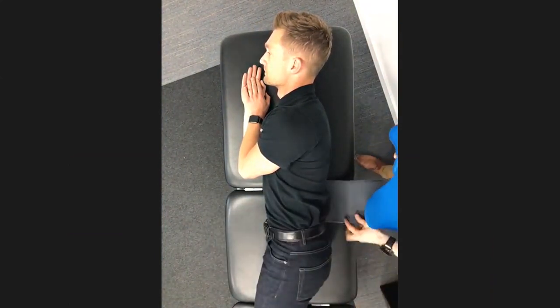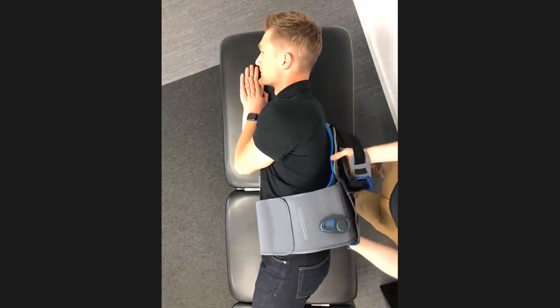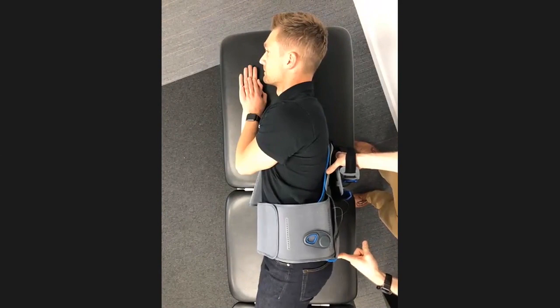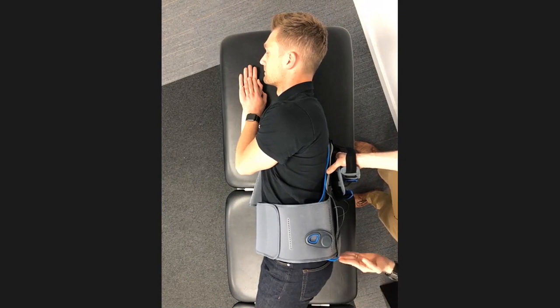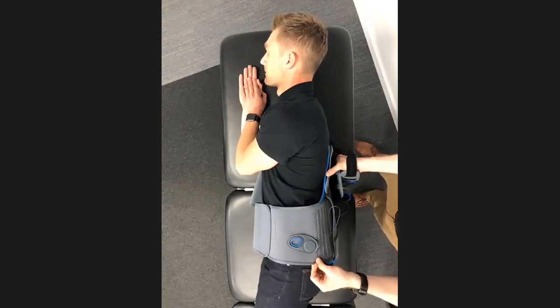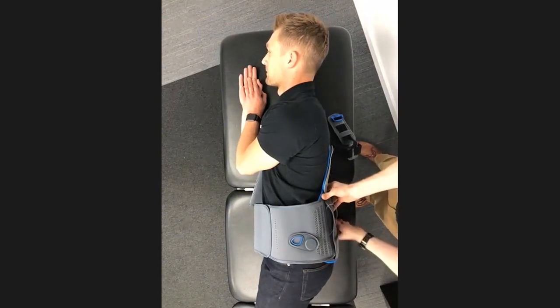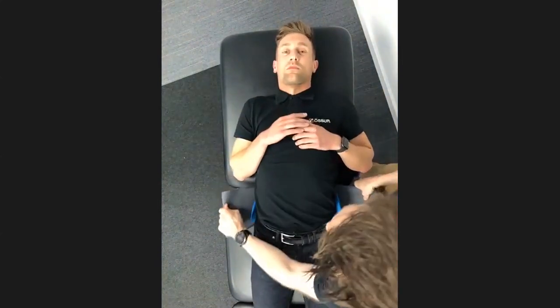It's important to think anatomically about how we position this. So we're pushing this underneath the patient, pushing down into the supporting surface, and we want to make sure that the base of the panel is just at level with the tip of the bottom. So we're making sure that we've got this position correctly. What we don't want is to have it too high, because we're not going to be getting the control down to L5S1. And effectively with the belts, we're wanting to capture the iliac crests in order to maintain control further down the spine. So as we log roll the patient back, we're applying a degree of pressure to make sure that we keep this nice and central and keep it in the correct position.